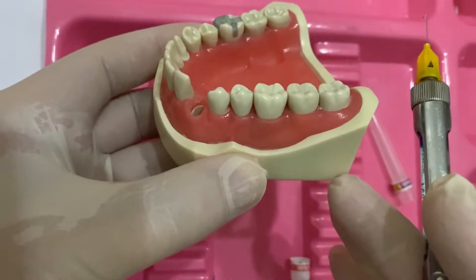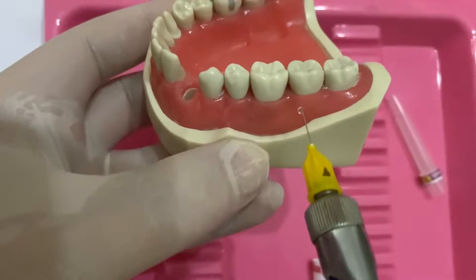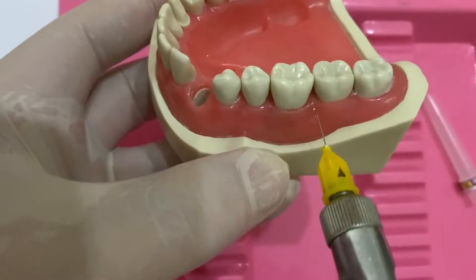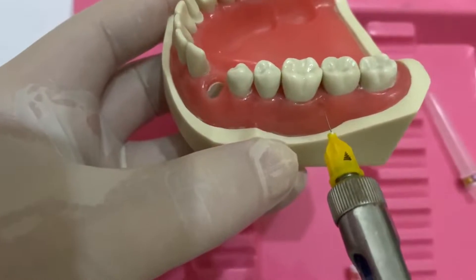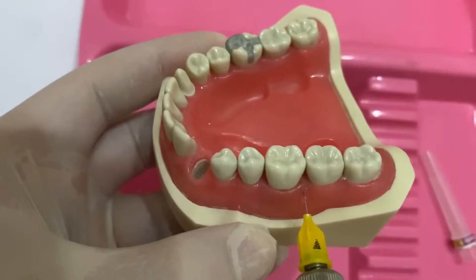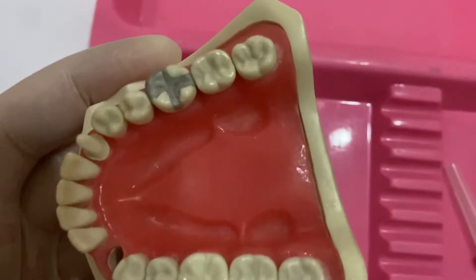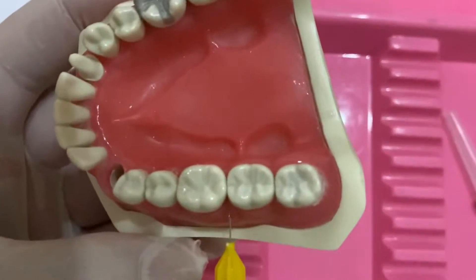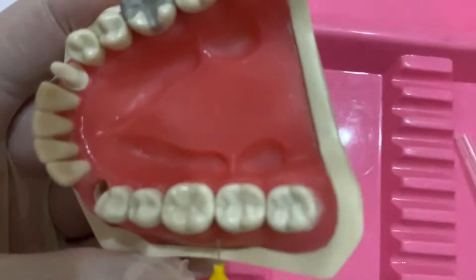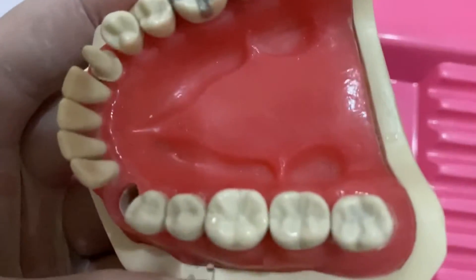In this technique, we advance the needle in the interpapillary area and advance it a little bit until we reach the other side without penetrating it. We should provide a few drops of local anesthesia on the mesial and on the distal.